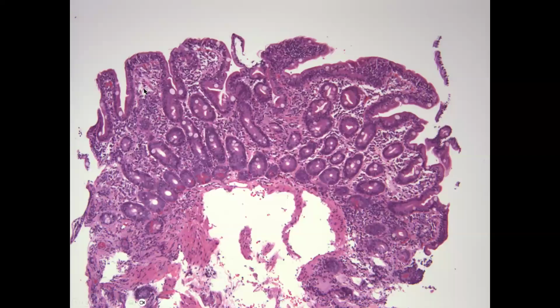Here's an example of an abnormal duodenum. Just from low power, you realize, oh, wow, the villi are really short in here. They're actually, rather than being 5 times longer than the glands, now the glands are maybe 2 or 3 times longer than the villi. And so villi are clearly blunted here.